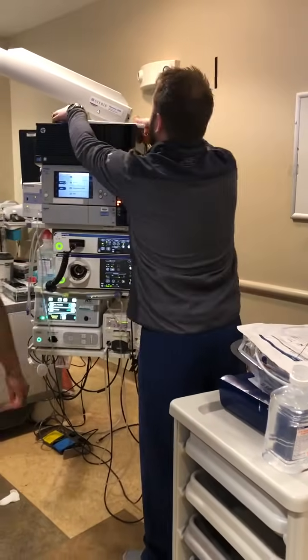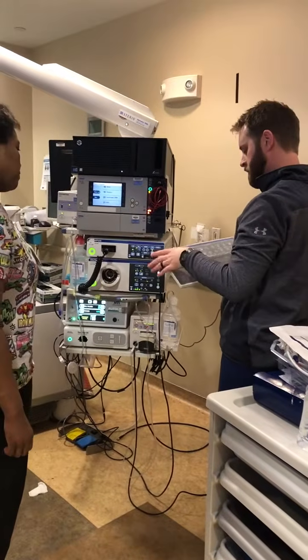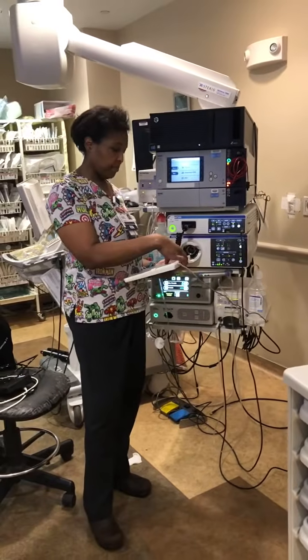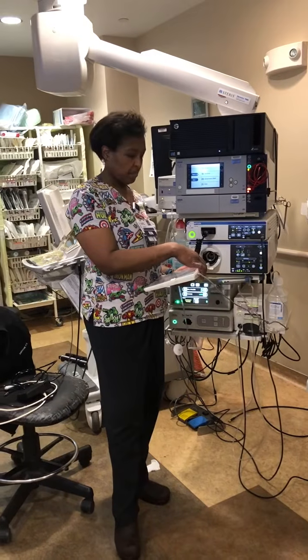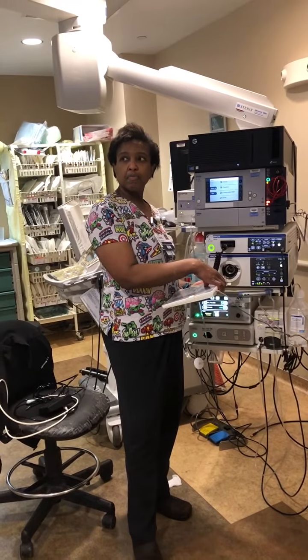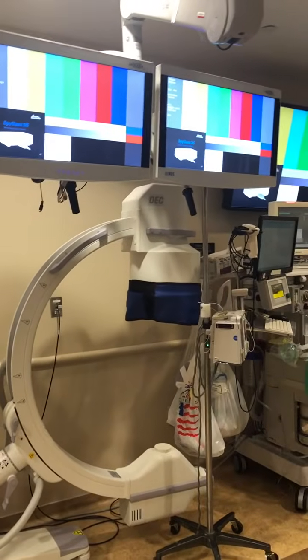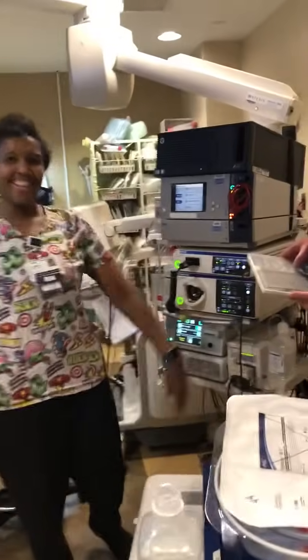Okay? So if you would, please give me a spy image on the monitor. Alright, make my spy image big. Okay, I only want to see spy. I only want to see endo and a little spy. Please turn off Spyglass. You're awesome. I'm the rock star.